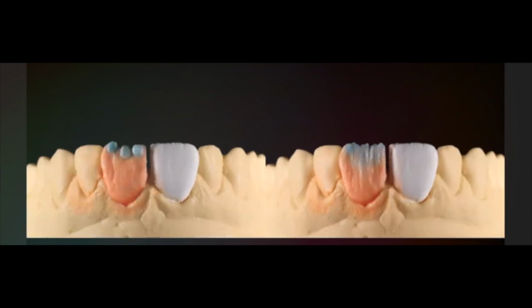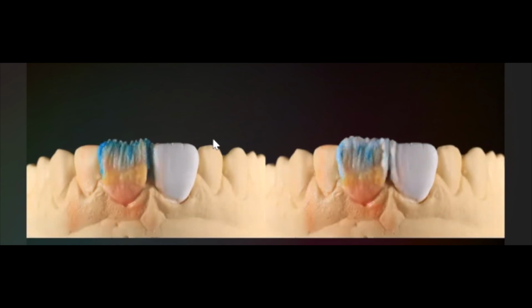So we do the same with dentine. Dentine mixed 50% with opal material in order to apply more opalescence. At the same time, we start layering the partial veneer for the 11 central. The blue in the middle and opalescence around the dentine. Primary micromamelons inside. And then up to the opalescent material. We cover it with enamel, and then we cover everything with pure opalescent transparent, LTX, or Noritake EX3.